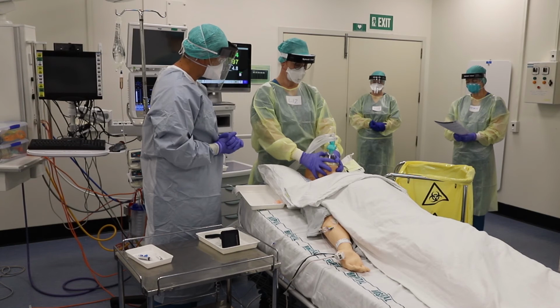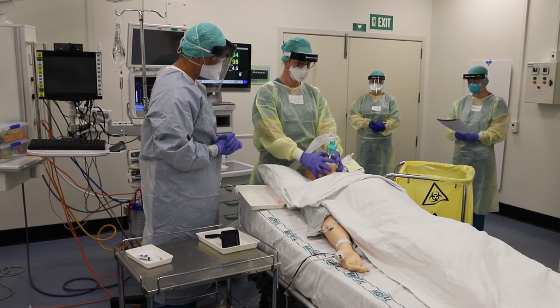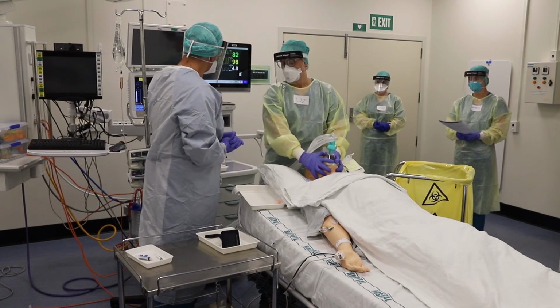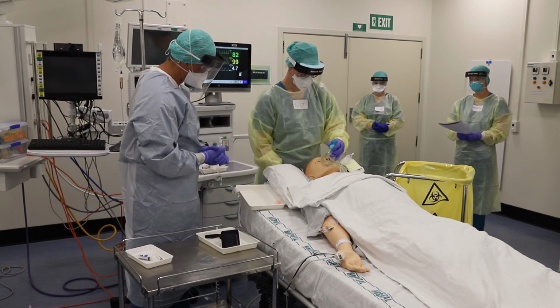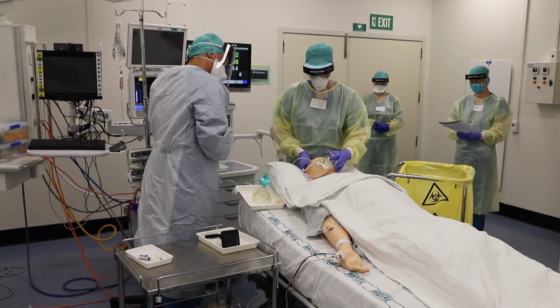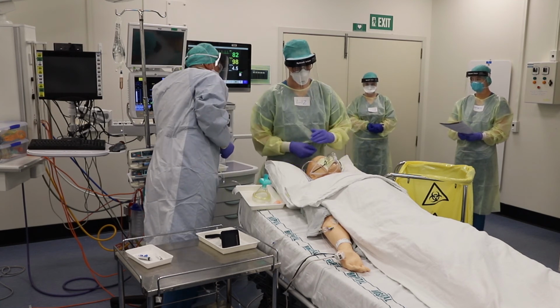Please listen to this full statement before starting. When appropriate, remove face mask and place with filter into dirty tray. Immediately apply surgical mask. Hudson mask to be placed over surgical mask. Tech, turn on auxiliary oxygen supply. Looking good. Put that under the pillow. Sounds good. Yeah. And 6 litres of oxygen, please. 6 litres coming up. 6 litres.